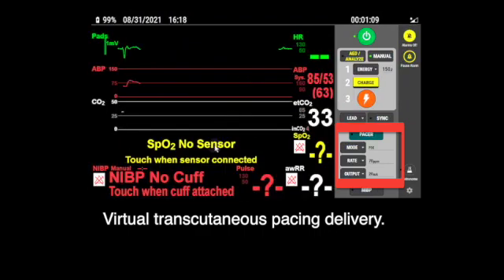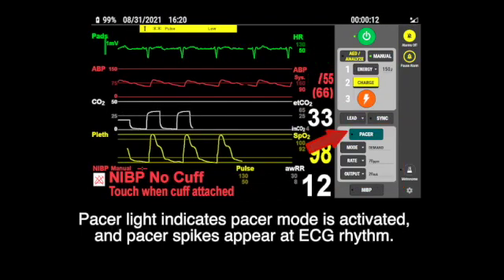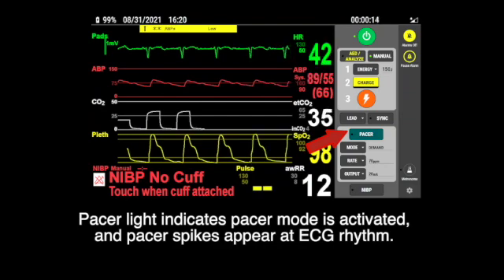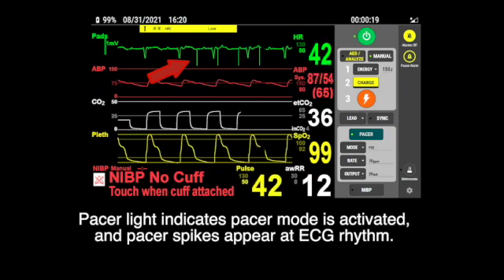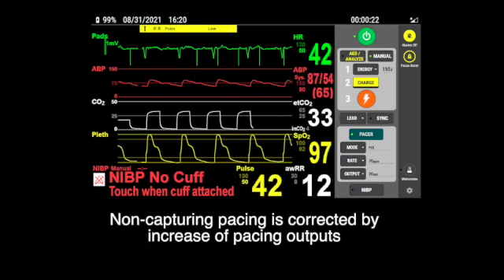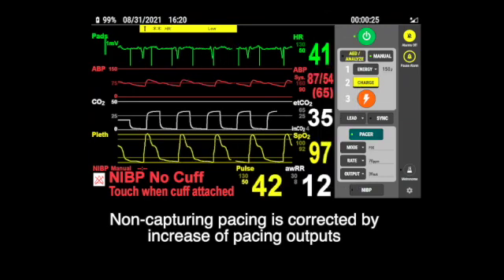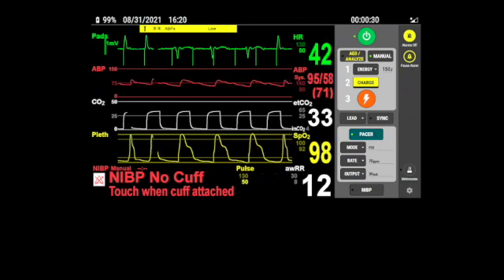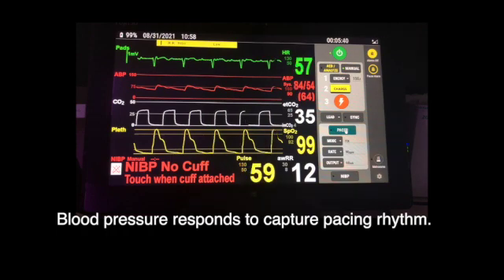For virtual transcutaneous pacing delivery, the pacer light indicates that pacer mode is activated and a pacer spike appears on the ECG rhythm. Non-capturing pacing is corrected by increasing the pacing output. Blood pressure then responds to the capture pacing rhythm.